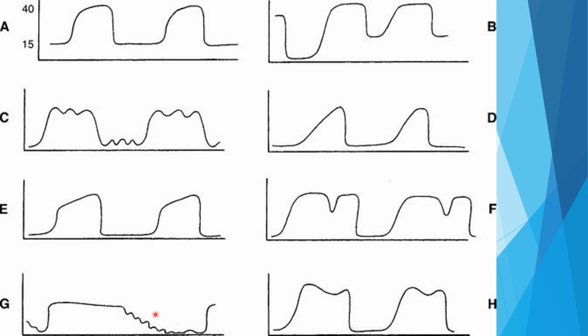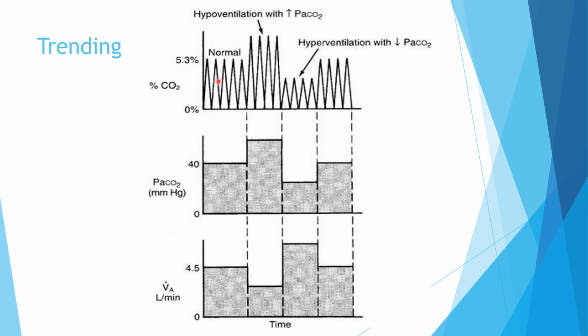This is uneven carbon dioxide levels seen at the end of expiration, caused by a patient's heart pumping fresh blood and CO2 into the emptying lungs, or cardiac oscillations on the screen. This could also be caused by exhalation valve fluttering. A good way to tell is if you match those oscillations to the heart rate, it's going to be cardiac oscillations. And here is what we call a biphasic curve, or a biphasic plateau, and this may be seen in patients with lungs that have different compliance and VQ matching, so you might see this in maybe single lung transplant patients. Again, you can trend.